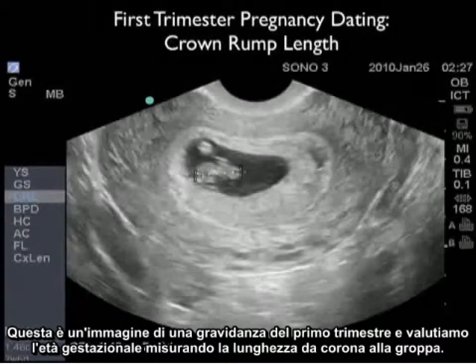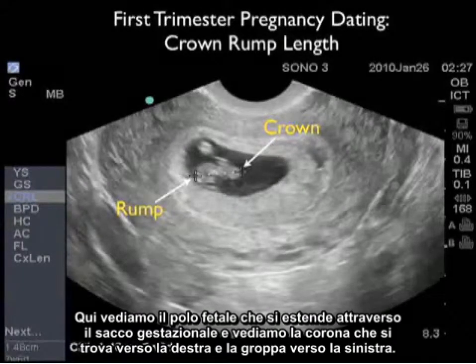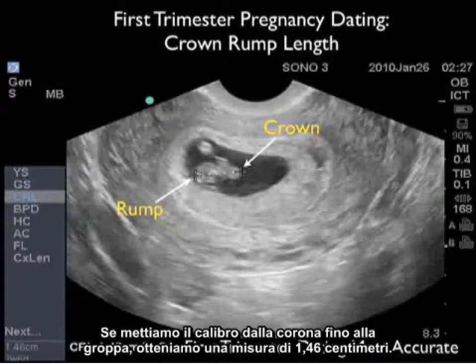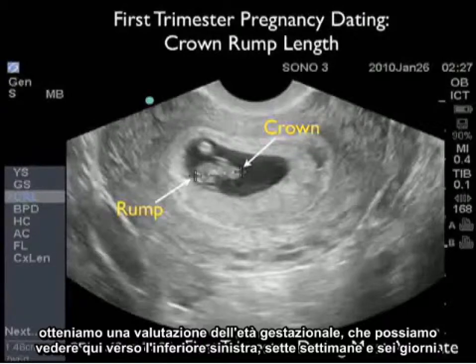This is an image of a first trimester pregnancy, and we're going to evaluate the gestational age by measuring the crown rump length. Here we see the fetal pole stretched across the gestational sac, and we see the crown located over towards the right and the rump towards the left. If we put the calipers down from crown across to the rump, we get a measurement of 1.46 centimeters. Now, by selecting crown rump length in the software package on the ultrasound machine, we'll get an assessment of gestational age, which we can see here towards the bottom left, 7 weeks and 6 days.